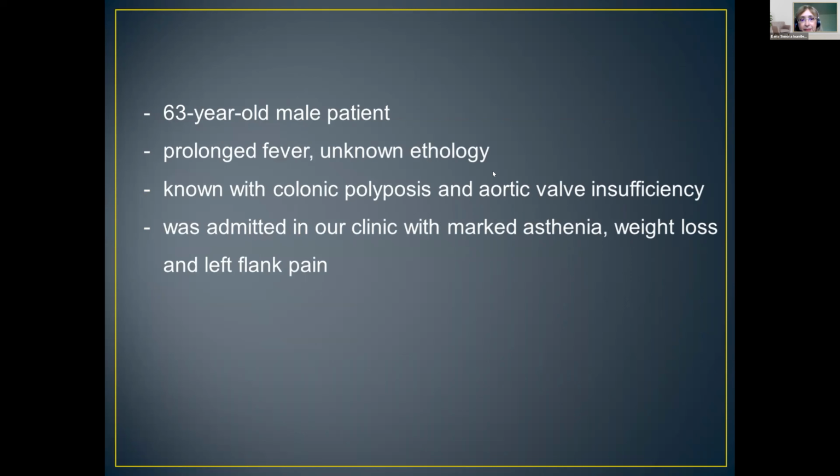63-year-old male patient with prolonged fever of unknown etiology, known with colonic polyposis and aortic valvular insufficiency, who was admitted in our clinic. Can you see me? Can you hear me? Yes. In our clinic with marked asthenia, weight loss, and left flank pain.